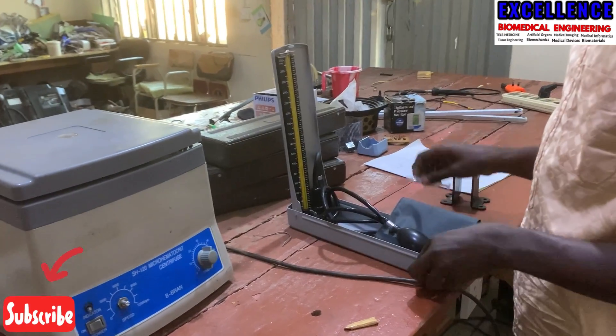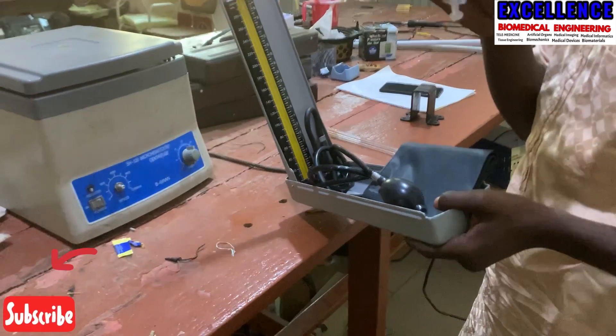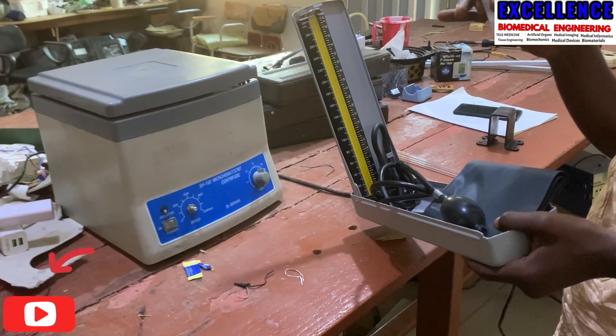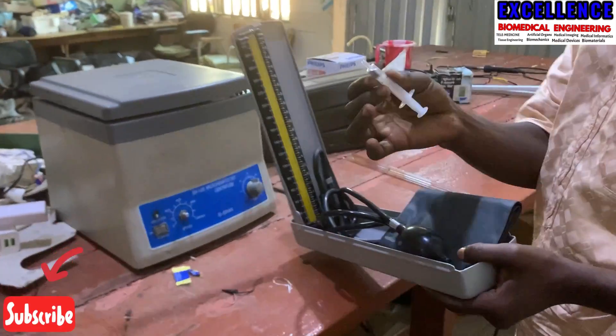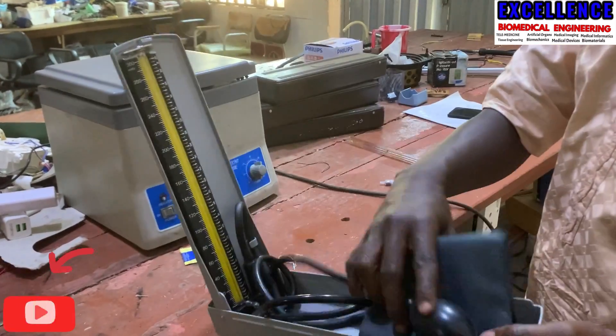Hello guys. On today's video I'm going to show you how to refill your mercury signal manometer. A lot of you might have been wondering how you refill it in case the glass is broken and you change the glass. So this is the mercury in our syringe.